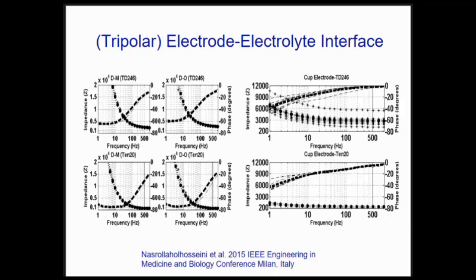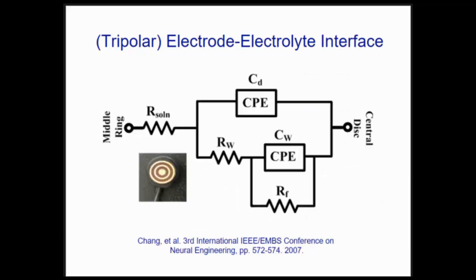And so what we're seeing is that we want the impedance to be high between our rings. And so we're starting out here quite high, and then as we get into the higher end, it's lower impedance there. And if you think about that paste, okay, it's doing the same thing to us here, so that as we get up into these higher areas of frequency, the impedance to the skin is being lowered as well.